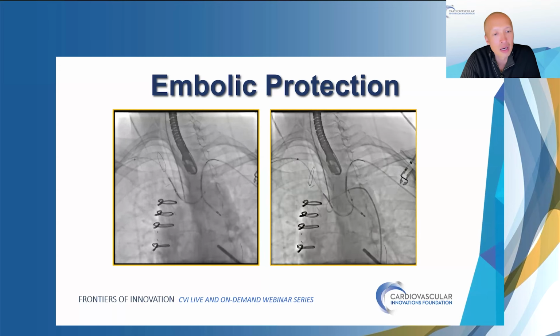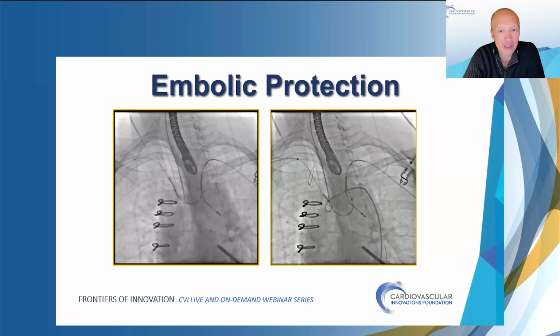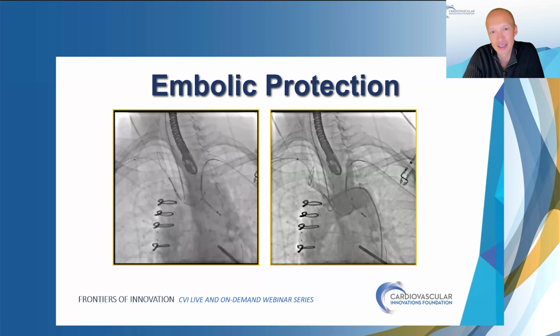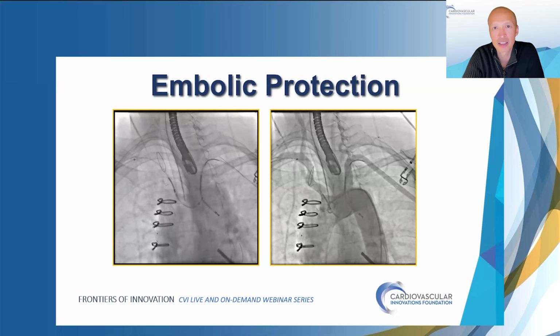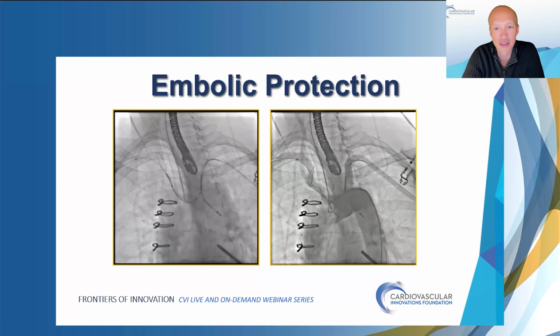And so you can see here, Nadira's put the slides of the Sentinel deployment. It was actually relatively straightforward when I found out where the origins were. But one of the challenges from the right side was that it was almost a bovine origin on the anatomic right, and then just coming across.